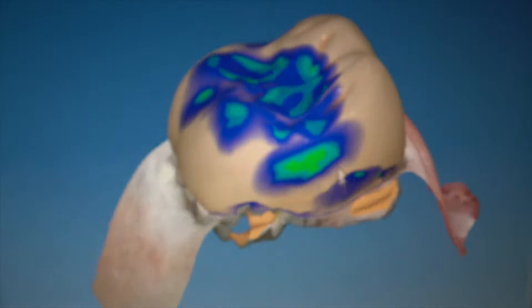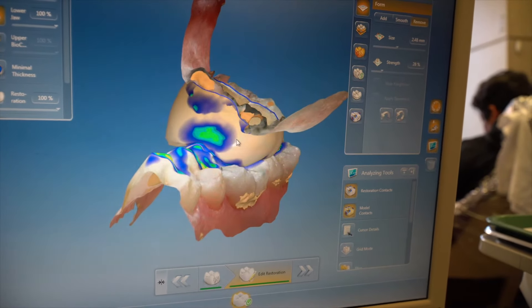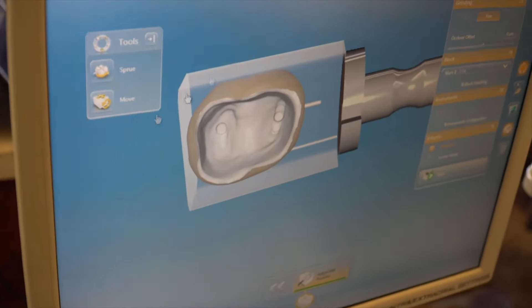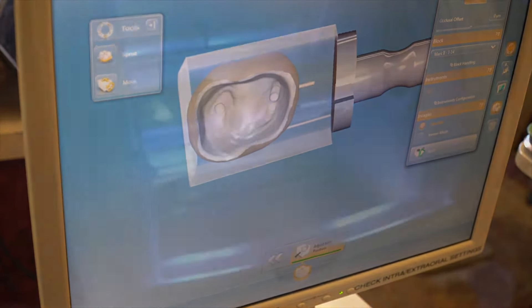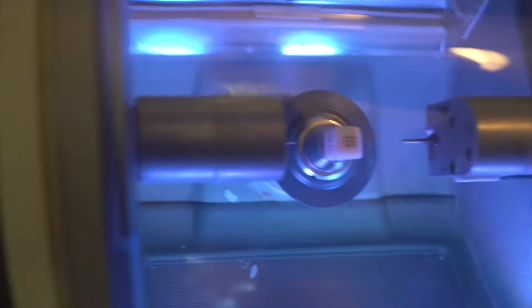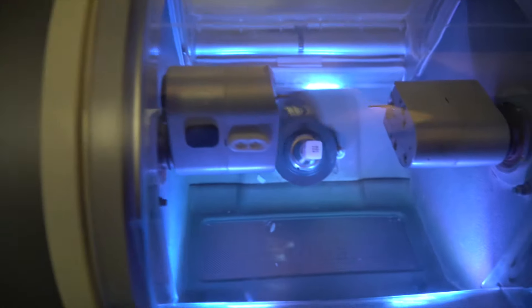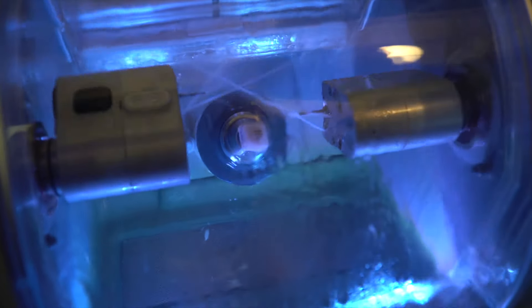These colors are showing the way the bottom tooth is touching the crown. It's important that you have nice contacts and the bite is working in a balanced fashion. Here's the crown — it is a representation of the block that the machine is going to mill it out of. The CEREC milling chamber has our block in there, which is a solid piece of ceramic. Now the machine is going to use diamond burs — similar to a CNC mill in other industries, but very specialized for dentistry — to take that CAD file and mill out the crown.